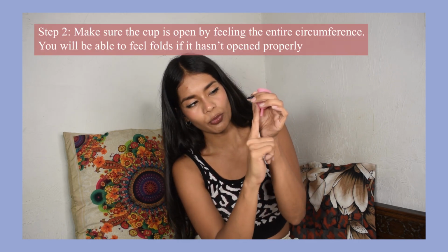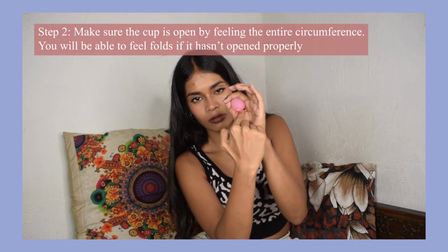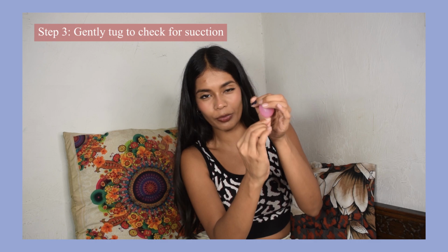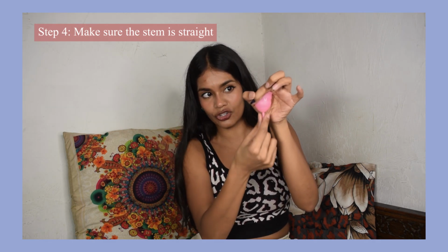Then what I do is I'll just put my finger and check from all sides to make sure that it is a circular thing and there are no folds. Because if there's a fold, you will know. And also just tug it down a little bit to make sure that the suction is there. Don't tug too much because that can get painful. One more thing is it should not be crooked like this because then it will leak. Make sure that the stem is completely straight.